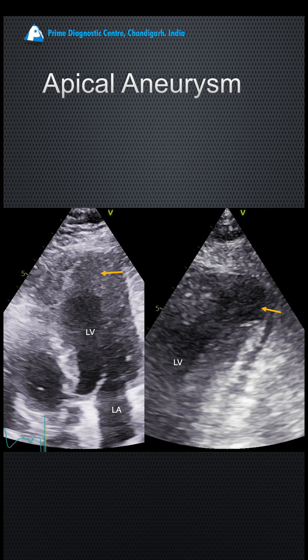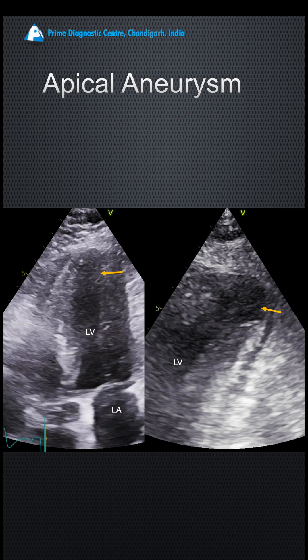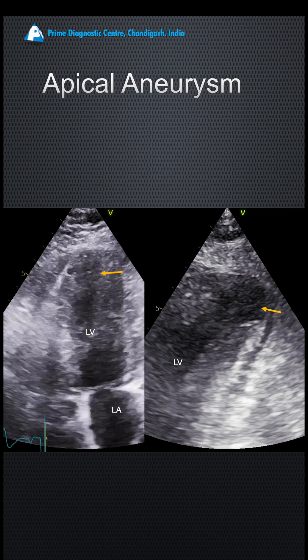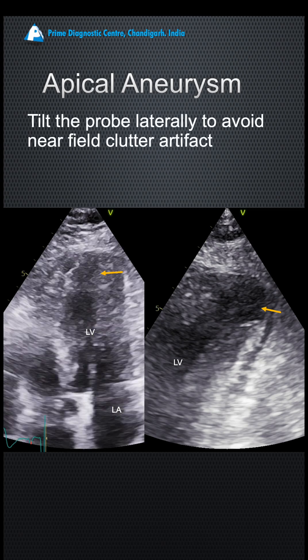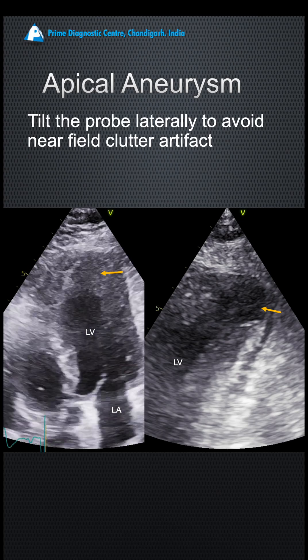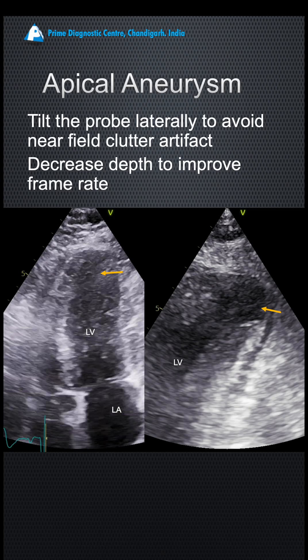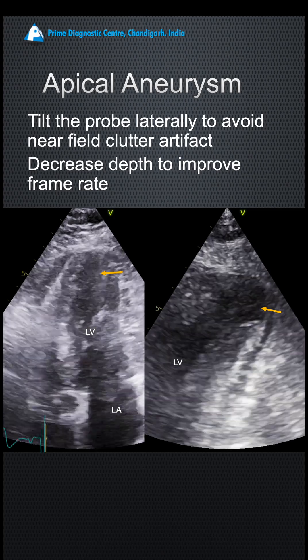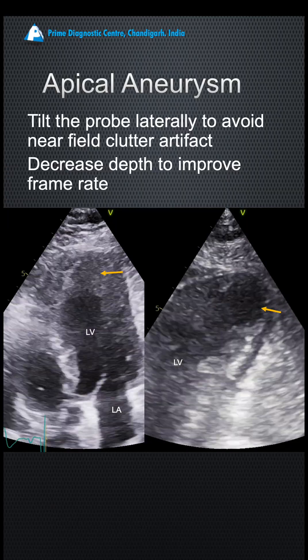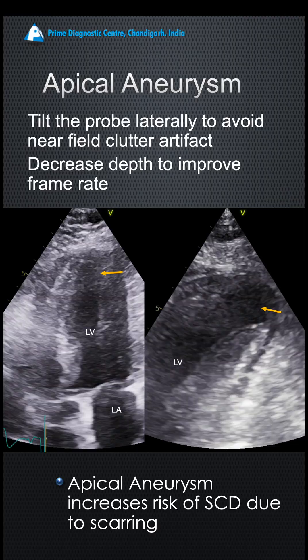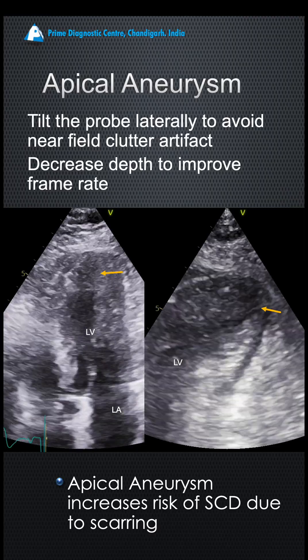But the story doesn't end here. You must rule out apical aneurysm in all patients with hypertrophy because the outcome becomes very different. There was a suspicion of apical aneurysm, so we rotated the probe slightly laterally to get rid of the near-field clutter, reduced the depth to improve the frame rate and thus resolution, and we could see a very clear aneurysm there, about three centimeters in size.